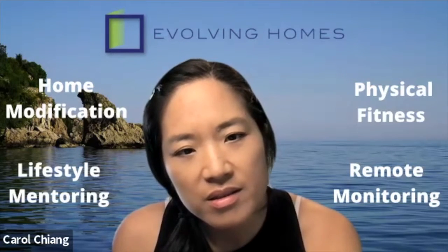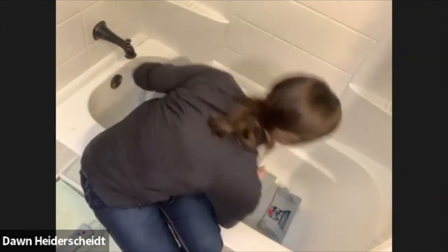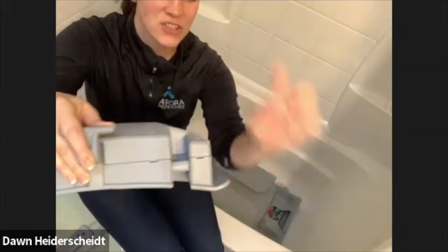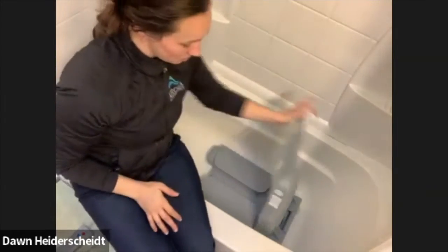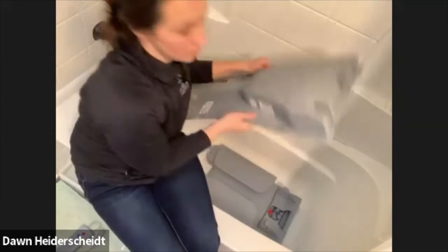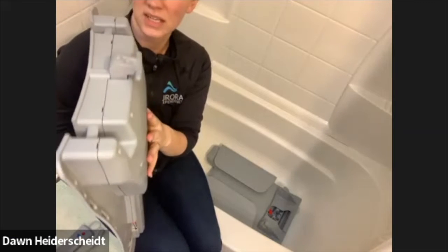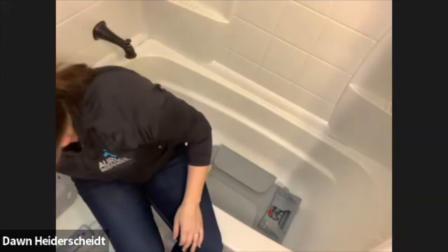Then literally you just take this off — I'm going to remove this so I have one less thing to worry about, but you can keep it on if you want. It's just this little bar on the actual bath lift; there's a little hook and this fits into the hook. It's protected, but there is a little bit of thickness on the back of this chair. So that's one piece.